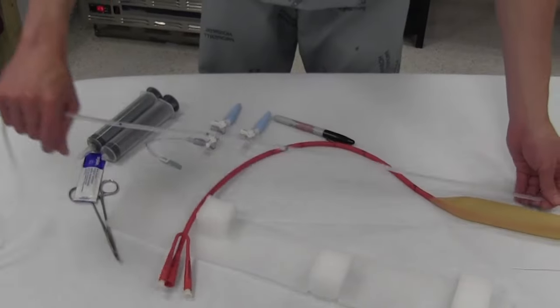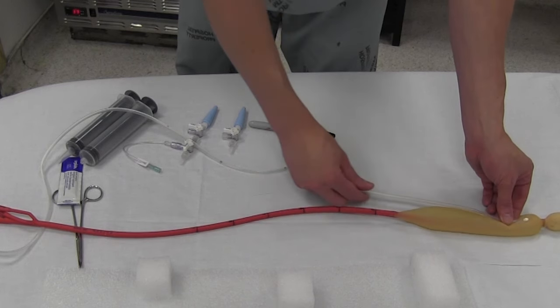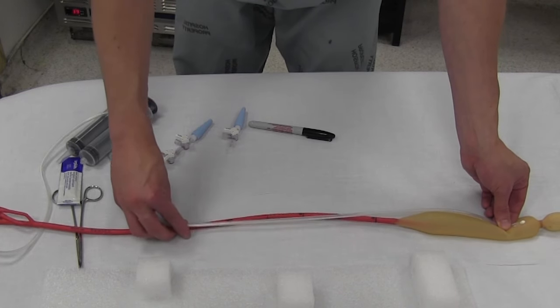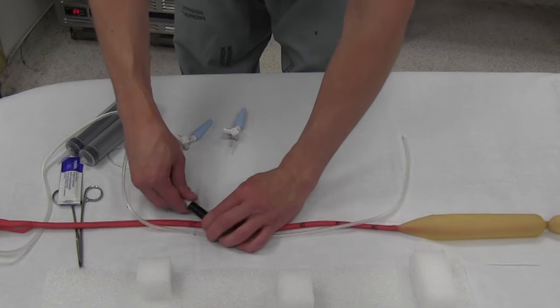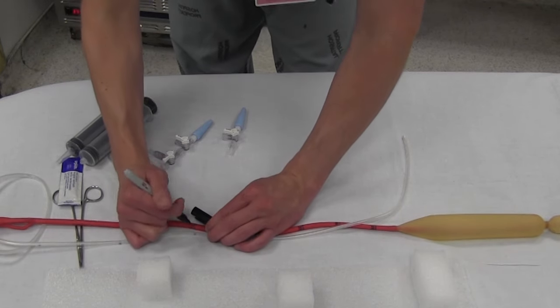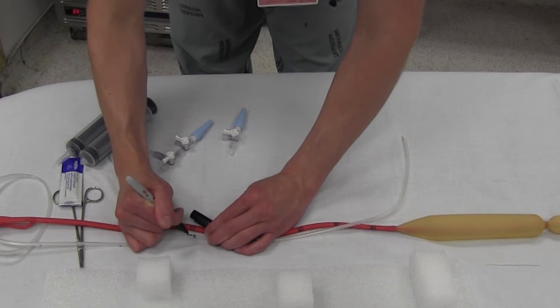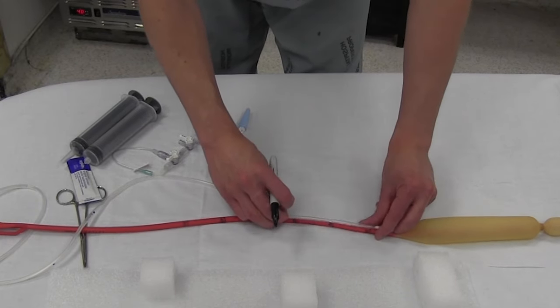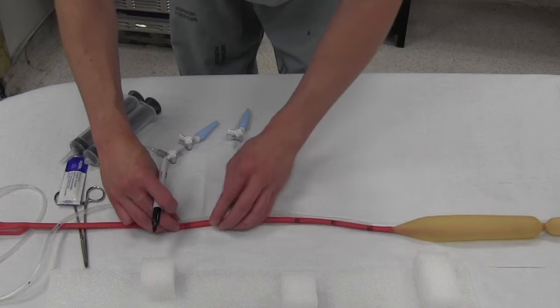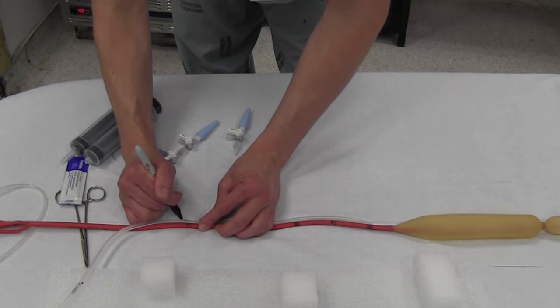What you want to do is mark two spots on the Salem sump. You want to mark about a couple of centimeters above the gastric balloon, and you mark that at the 50-centimeter mark on the Blakemore — we'll call it gastric. Then you want a couple of centimeters above the esophageal balloon, and again you mark that at 50 on the Blakemore — we'll call that esoph.